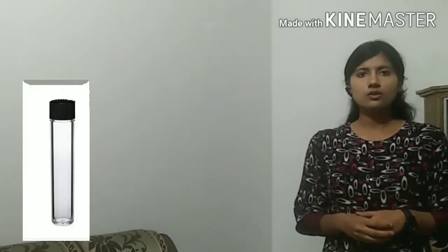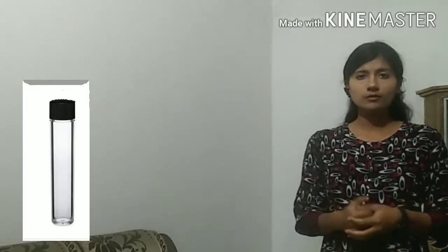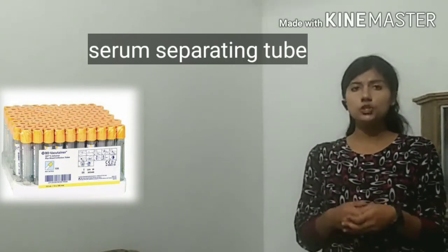Next, moving to the black vial. It is used only for a single test, which is an erythrocyte sedimentation rate test. If black vial is not available, then blue vial can also be used. Sixth, yellow vial. This vial is used for a large variety of tests which require separate serum for analysis. It is also known as serum separating tubes.